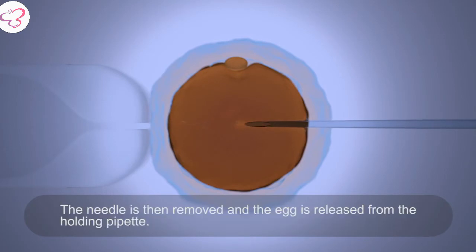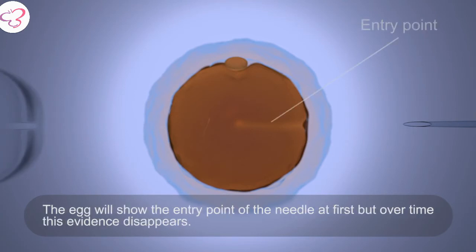The needle is then removed and the egg is released from the holding pipette. The egg will show the entry point of the needle at first, but over time this evidence disappears.